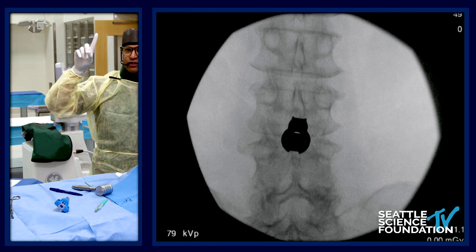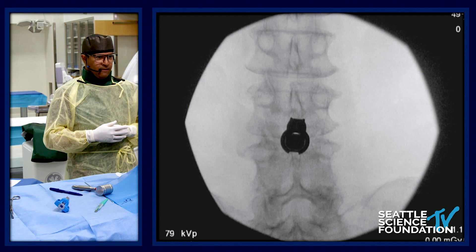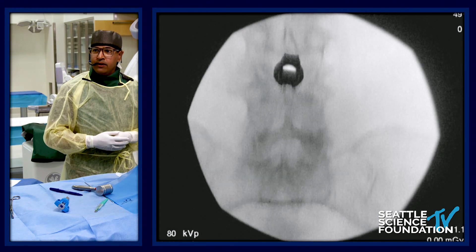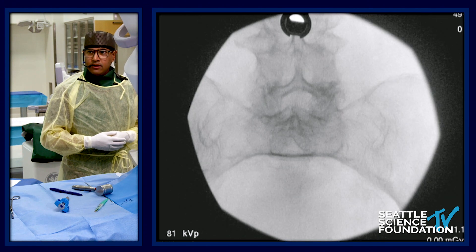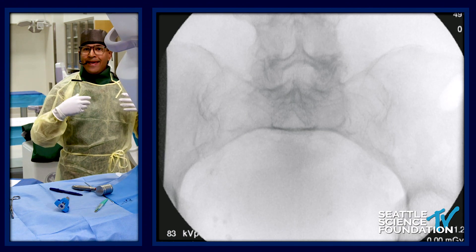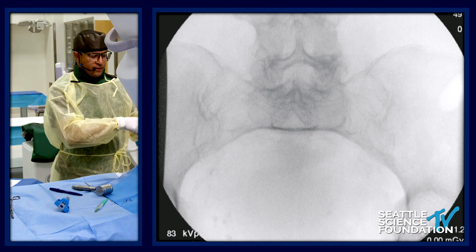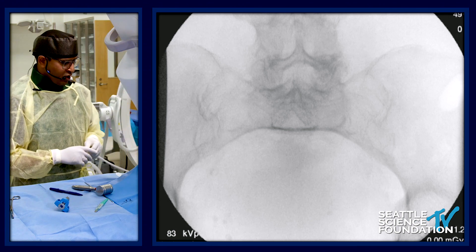You're seeing those two little nubs straddling the spinous process. People often ask if rotation is a problem, and the answer is really no. Think about this as a cylinder — those nubs at the end follow the natural path. If the spinous processes had a little bit of angulation before instrumentation, that's the natural path. Ideally we'd use a more caudal Ferguson view to see the nubs clearly, but you're getting a sense we're right on target.